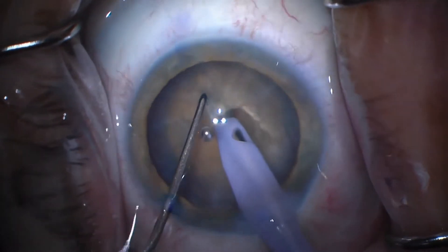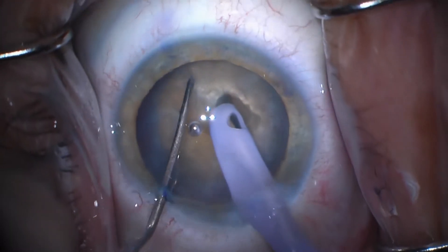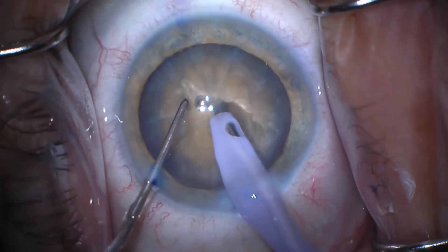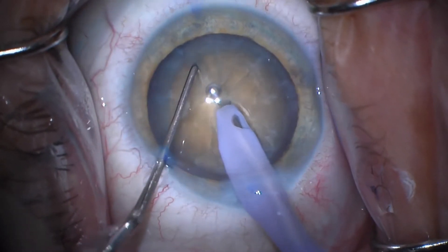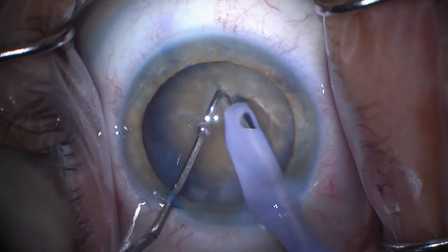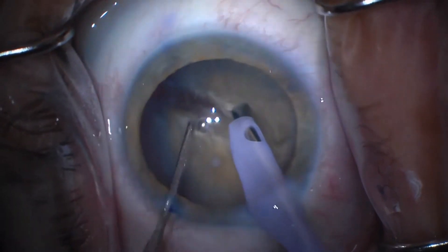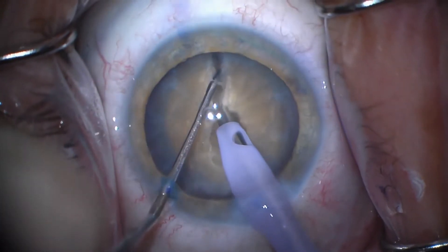I'm going to try again. I'm probably going to do it three or four times here before finally I get a good enough grip and get deep enough with the chopper that I'm able to do this vertical chop and have it work. Very close there. But each time I'm making a little progress, trying to keep it centered and not stress the zonules too much.